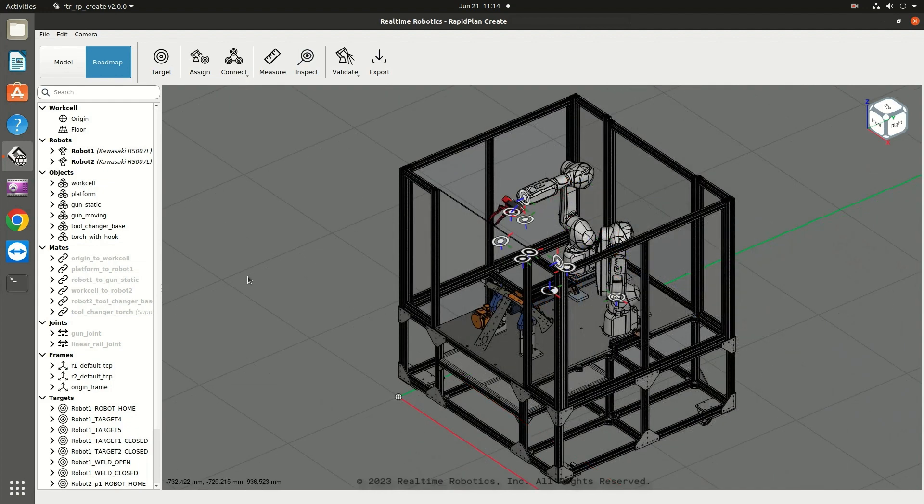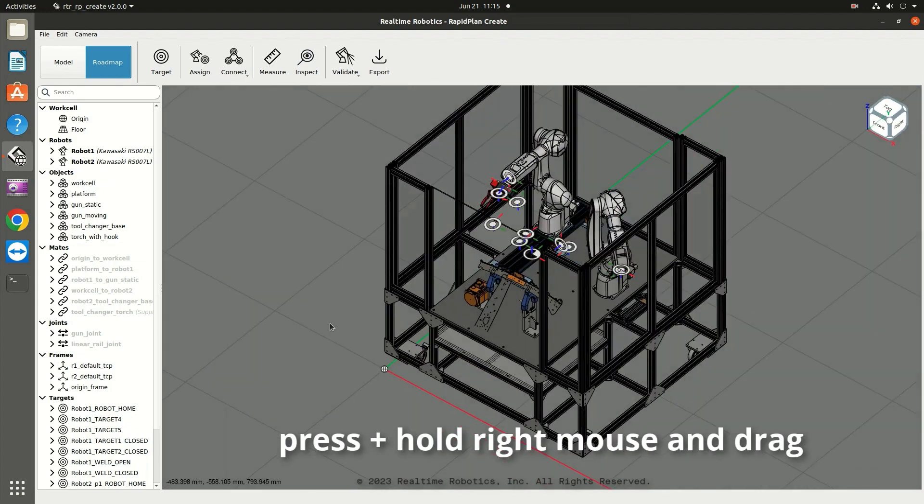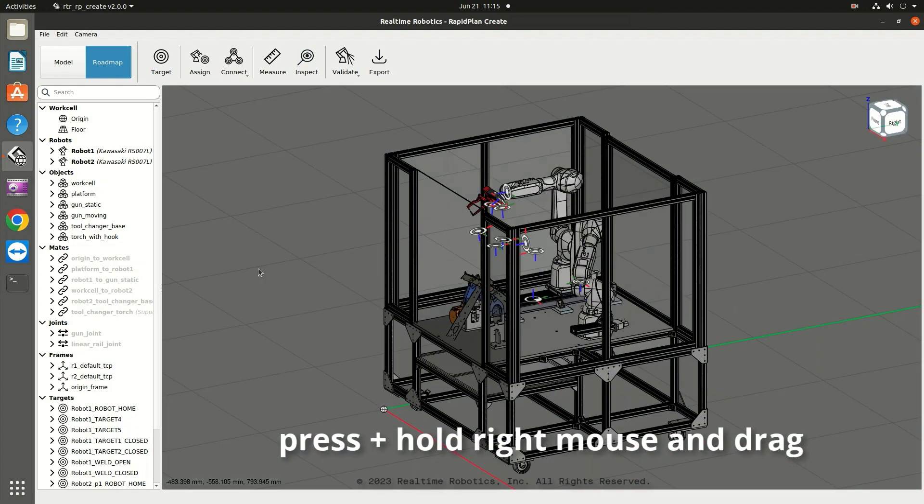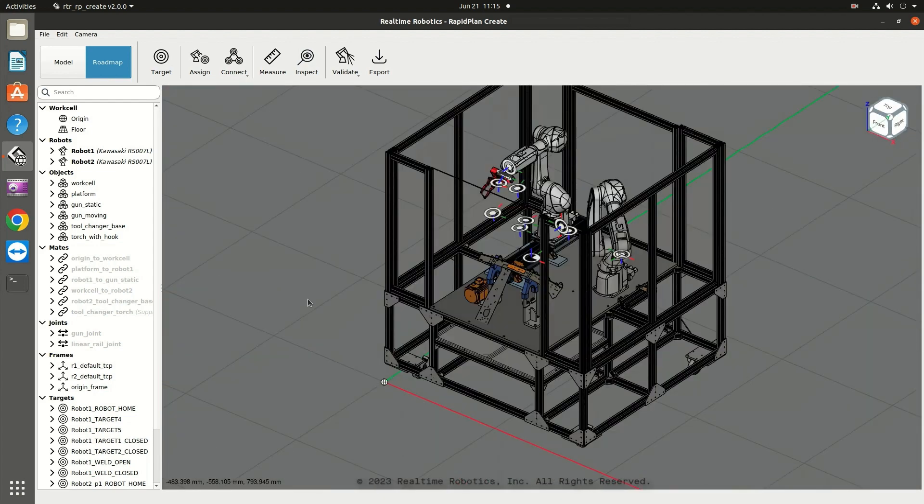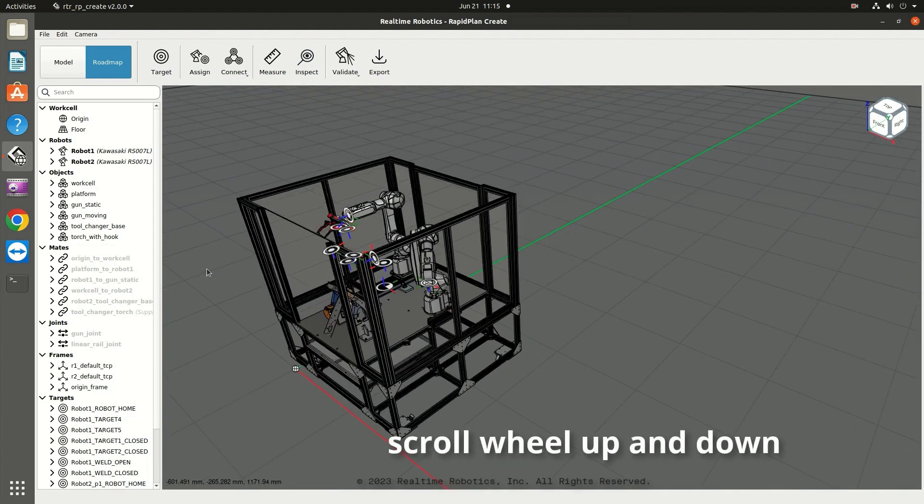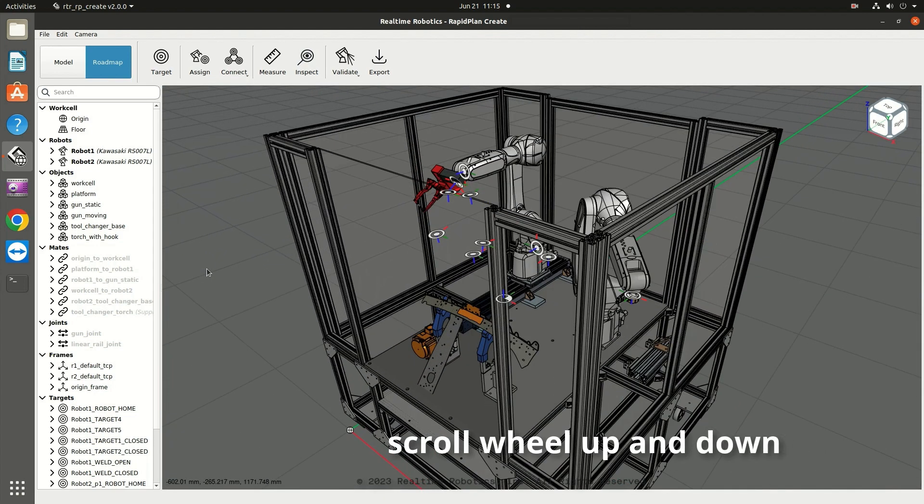To rotate the view, press and hold the right mouse button and drag. Zoom in and out by spinning the scroll wheel up and down.